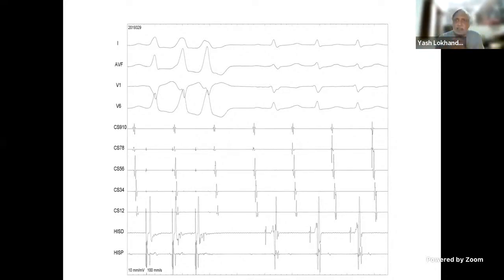This one question is, what is the ventricular echo beat? There is nothing like a ventricular echo. It's a very non-specific term. An echo means an extra complex that has come because of the pacing. So it could be an atrial echo. It could be an AV nodal echo as we showed. And it could be a ventricle echo. A ventricle echo is when you pace the ventricle and you get an extra beat, usually.